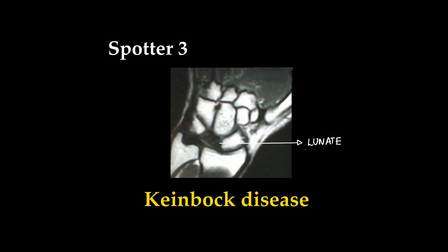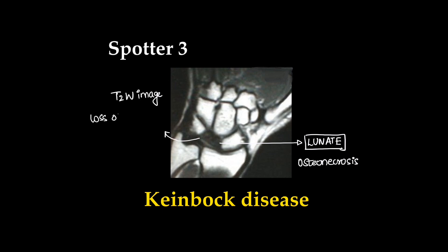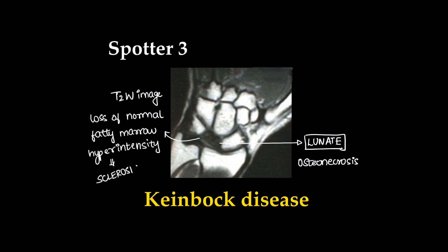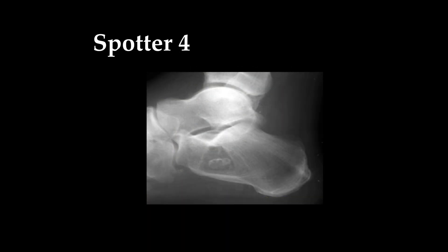This was Kienböck's disease, nothing but osteonecrosis of the lunate. Here we can see this is a T2 image where there is loss of normal fatty marrow hyperintensity, which shows there is sclerosis of the bone.